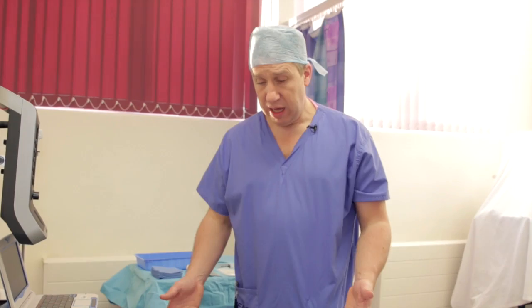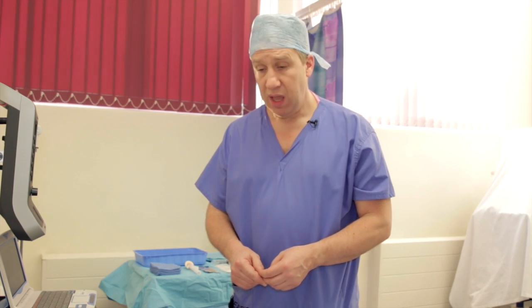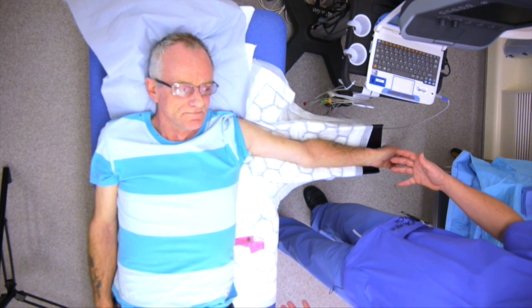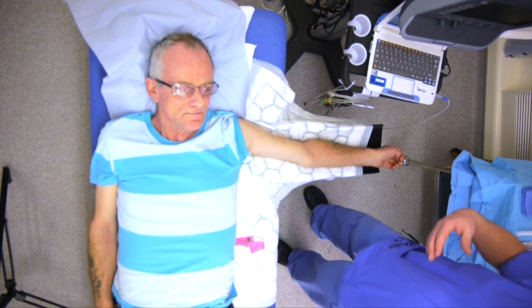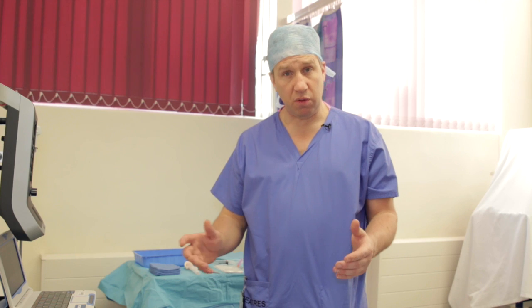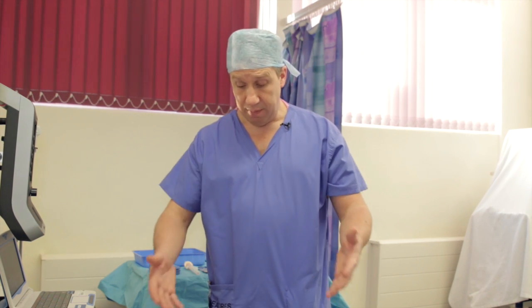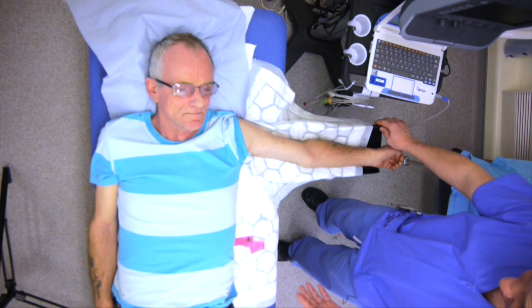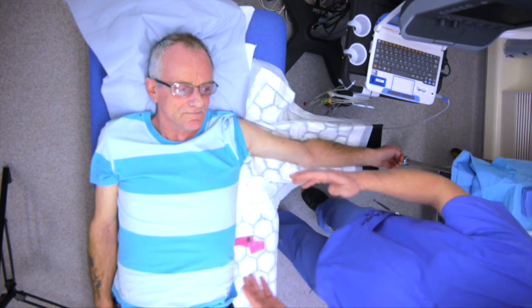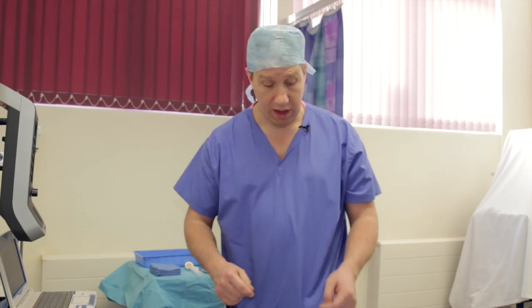When doing a PICC line, either the right or left arm can be used — it doesn't really matter. I generally prefer the left arm, but many people prefer the right. This is the position we normally use. I personally teach and always sit down during this procedure so I have a nice, comfortable, stable base. In terms of patient preparation, we have the patient on an arm board, and we connect up the Nautilus ECG to his chest.